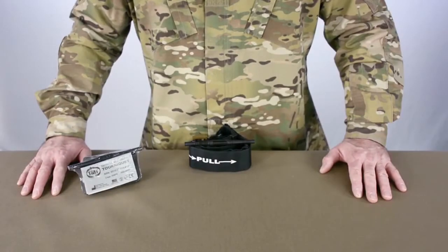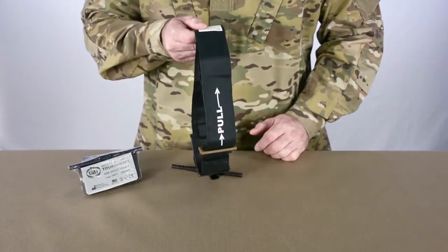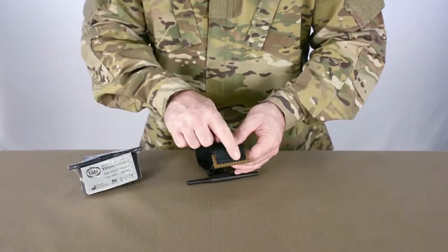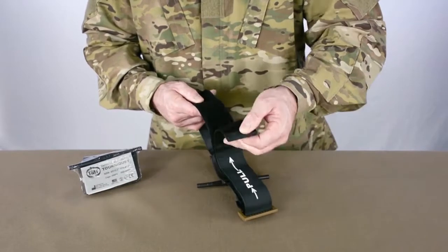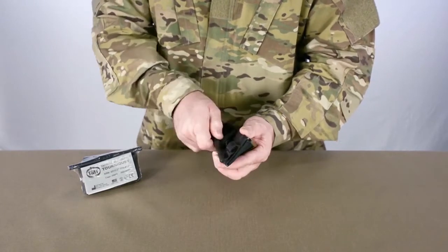The benefits include IR and UV resistant materials, packaging for true one-handed application, wider band for occlusion at lower pressure and increased comfort, dual locking mechanism to prevent slippage and loss of pressure, and an audible signature click that identifies the torsion bar and buckle are properly secured in place.